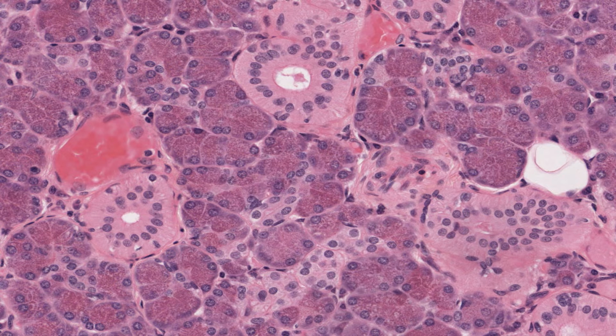In previous descriptions of the secretory cells of many glands, I've mentioned eosinophilic staining in the apical regions of the cells representing the proteinaceous secretory granules. They're very obvious in this image. Well, so too in this image is the basophilia I've mentioned previously in the basal region of the cell cytoplasm, where rough or granular endoplasmic reticulum and ribosomes reside alongside the cell nucleus. It was difficult to see in other images I presented, I must admit, but I think the basophilia is very clear in some of these secretory cells.